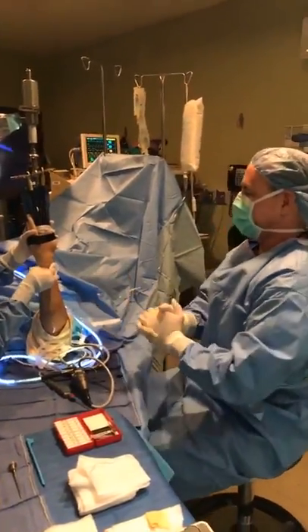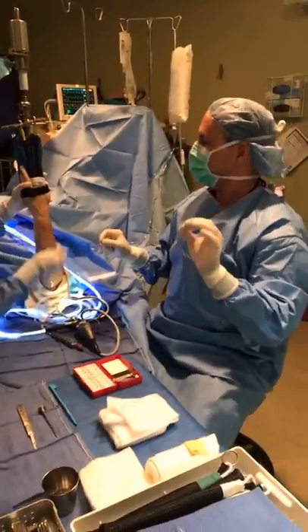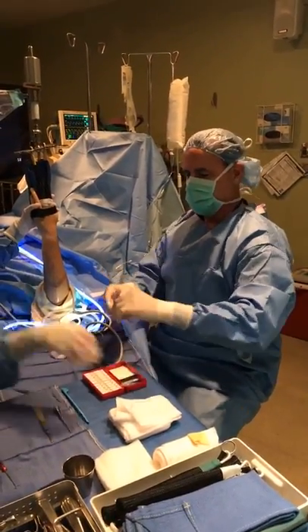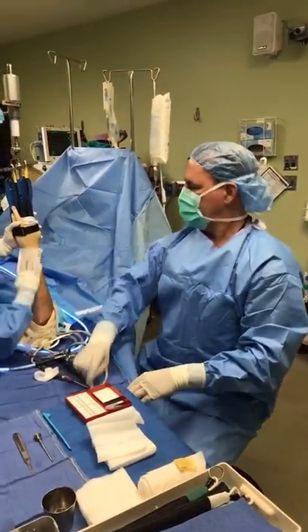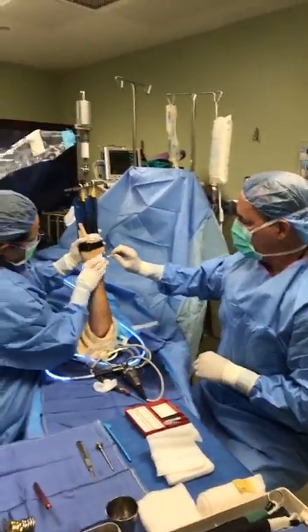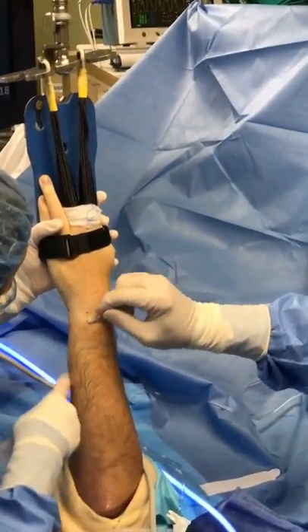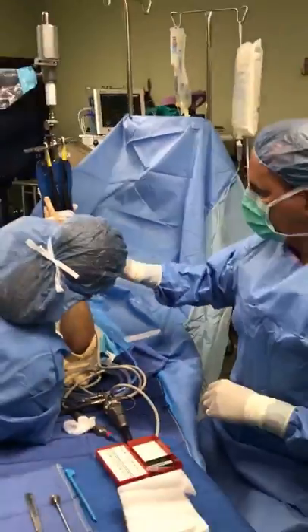So, all right. We are not even gonna put stitches in this. We're gonna use little steri strips, right? You got those, Denise? Yes. We're all set? Yes, okay. Dry it off. This is a little thing that makes it stick. So that one's a little bigger, but I think that'll be fine too, right?